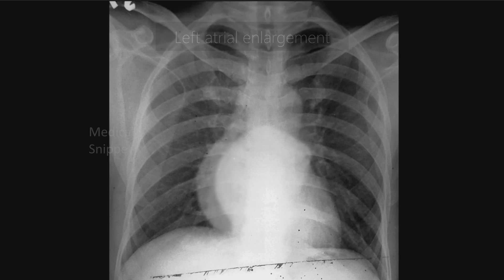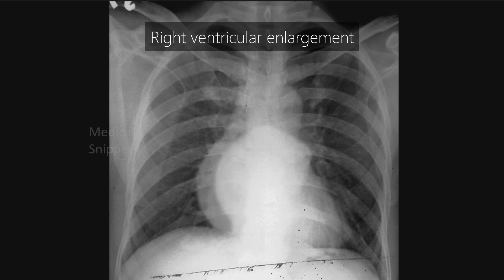In right ventricular enlargement, the cardiac apex is lifted upwards, and it is usually associated with a dilated pulmonary artery.